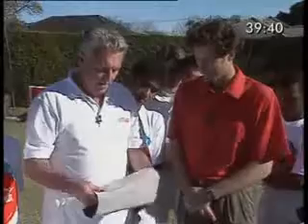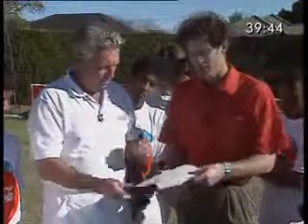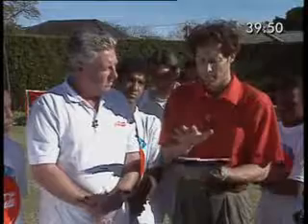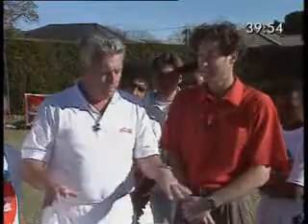I see this is for thigh strains and hamstring injuries, perhaps? Hamstrings, groins, quadriceps. This is just a thigh sleeve which will retain heat and apply a bit of extra protection to the injured area. It's very important, as you can see from this particular equipment and from all that we've said about sports injuries, that you must manage them, you must look after them carefully, and it'll prolong your cricketing season.